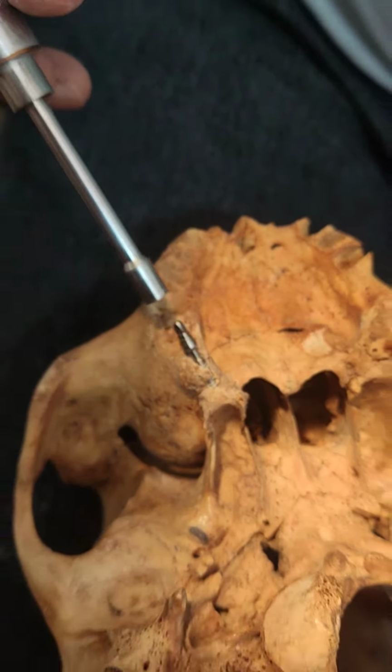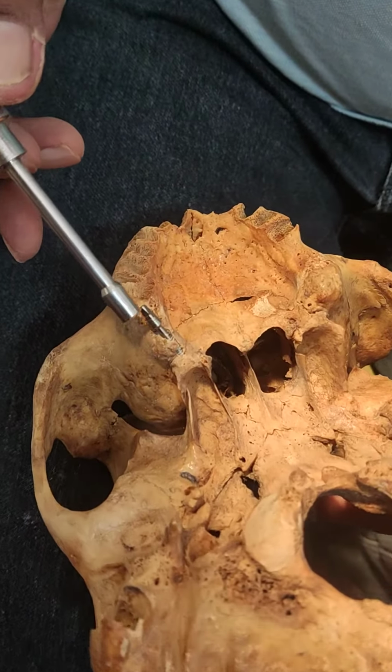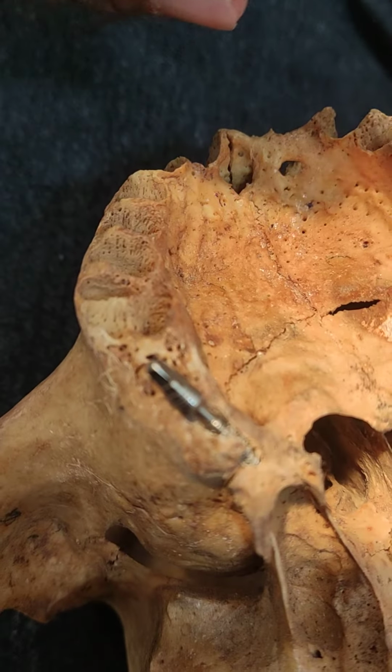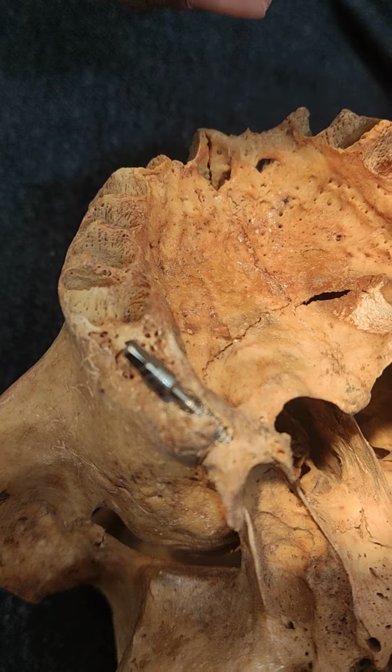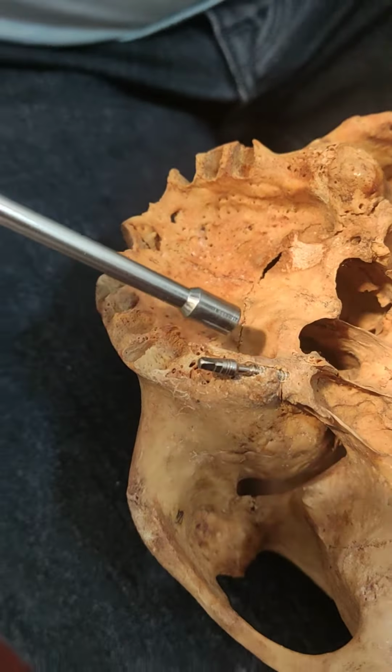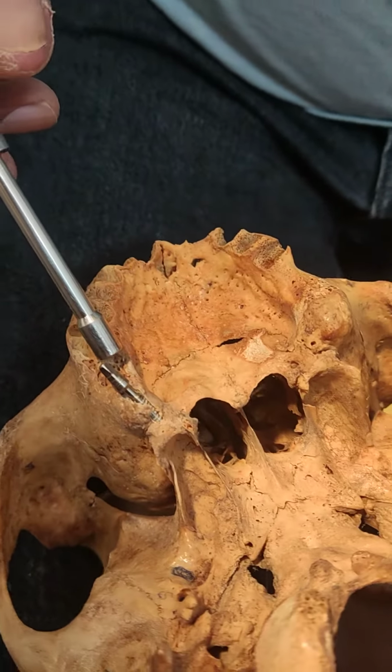So I've placed it now. So it's angulated. Can you see? I placed one. In the same way, it's on the right side also, on the tuberosity. Starting from the tuberosity, you can place another one. If you can place double pterygoid on both the sides, it should be well and good. Okay.